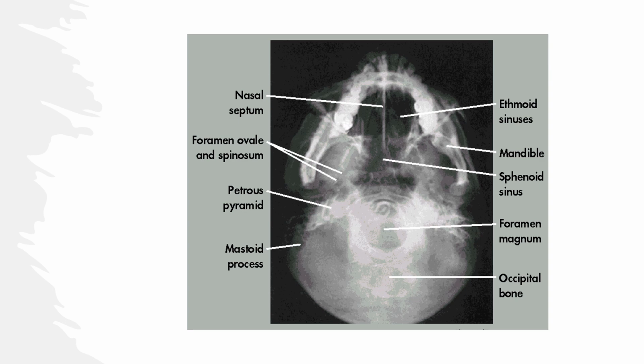Direct your central ray to the intersection of the midsagittal plane and a line that connects the angle of the jaw on the left side to the angle of the jaw on the right side. If you do it correctly, you should see the ethmoid sinus and the sphenoid sinus from below. The maxillary sinus should be occluded by the patient's molars, and the orbits also occluded by the patient's molars. Okay.